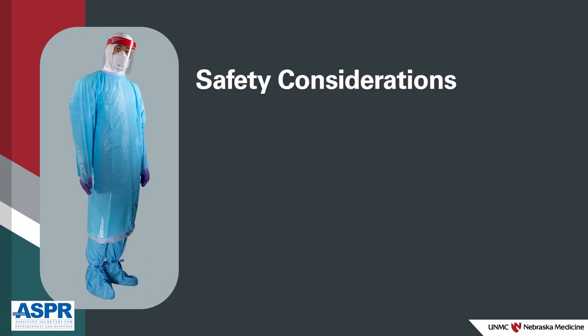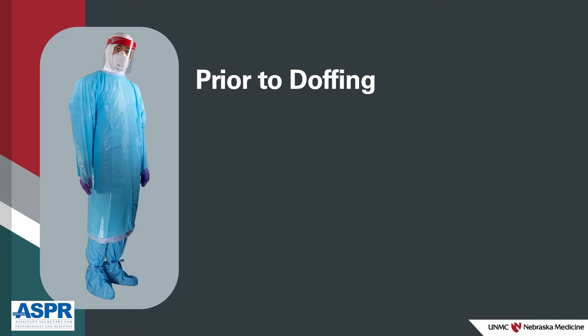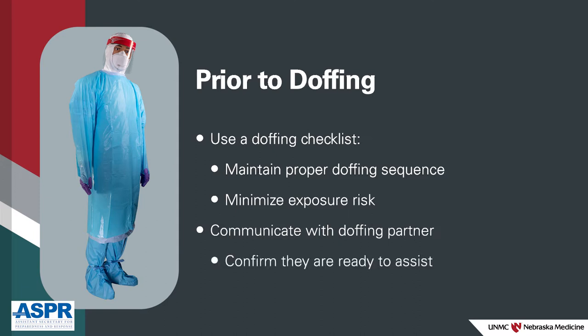It is imperative to doff in a slow, deliberate, and sequential manner to minimize the risk of exposure associated with potential pathogens on the surface of the PPE. The use of a doffing checklist is recommended to maintain proper doffing sequence and minimize your risk for exposure. Prior to leaving the hot zone to doff PPE, check with the doffing partner to ensure they are ready to assist you. You should only exit the hot zone when it is confirmed safe to do so.